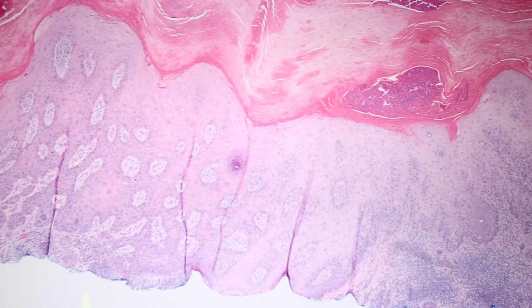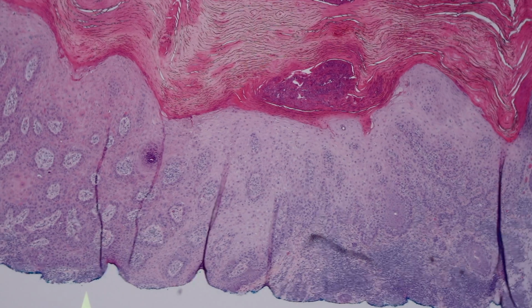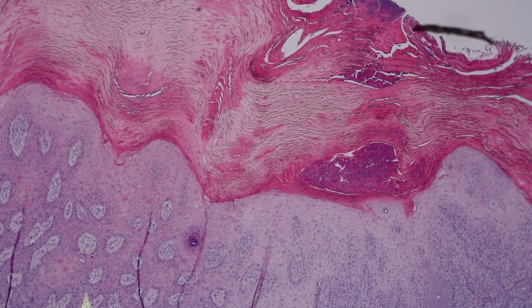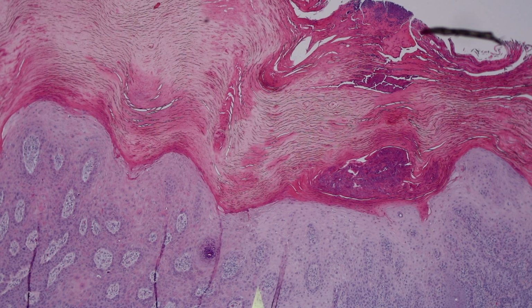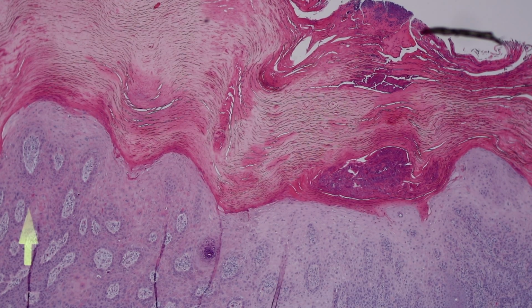And then the thing is that when you have something that's transected like this, that's the kind of time also where I might say at least actinic keratosis. Now, because especially, what if it was transected like that? What if the shave went right through there? And a lot of times that's what happens, not because the dermatologist is trying to be stingy or not give us a good shave, but because look at this massive layer of keratin on top. So a shave right through here would feel clinically to the dermatologist like they were getting a nice, thick, good shave biopsy.